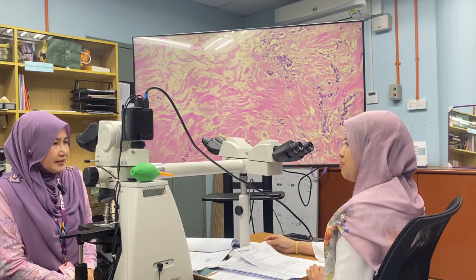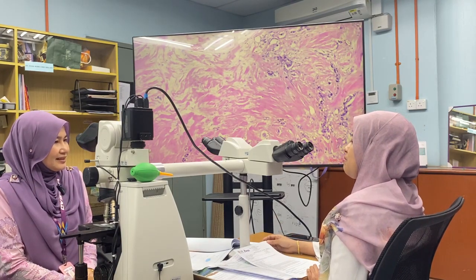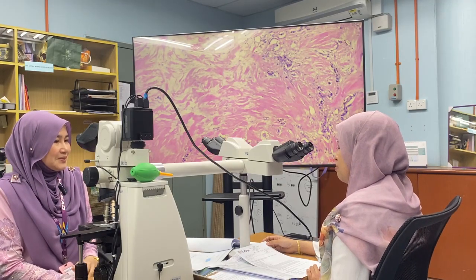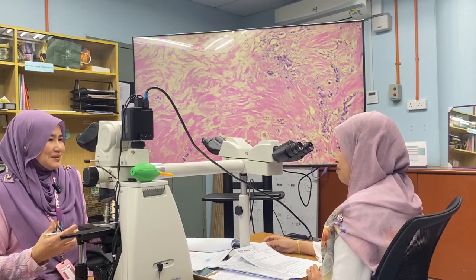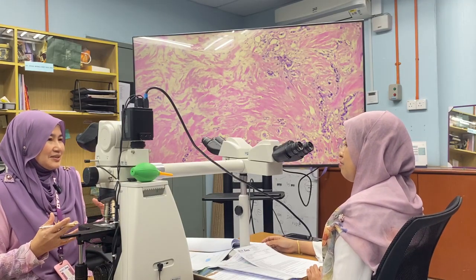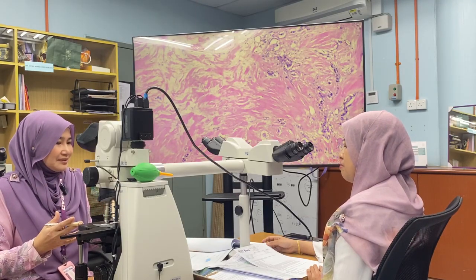All right. Myoepithelial. This is all that you need to describe in your report. So we know that there is some response to the chemotherapy with those changes, so we can assess the chemo response, right?